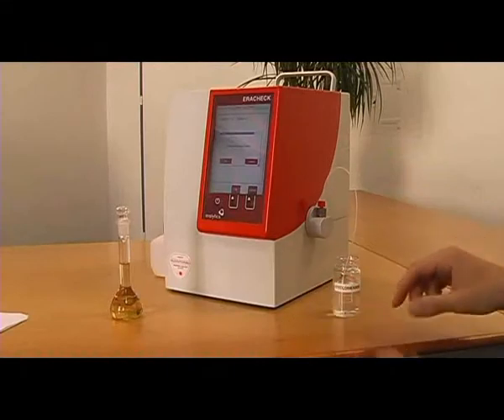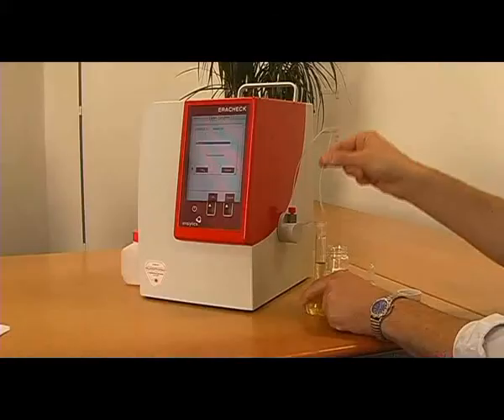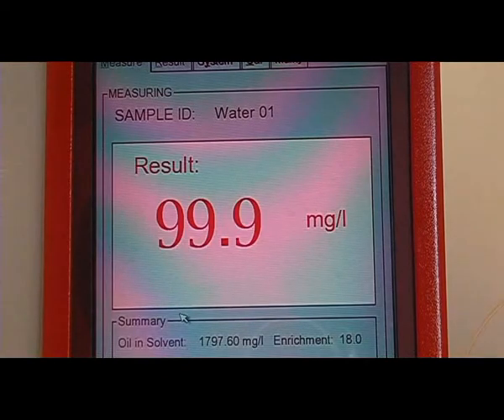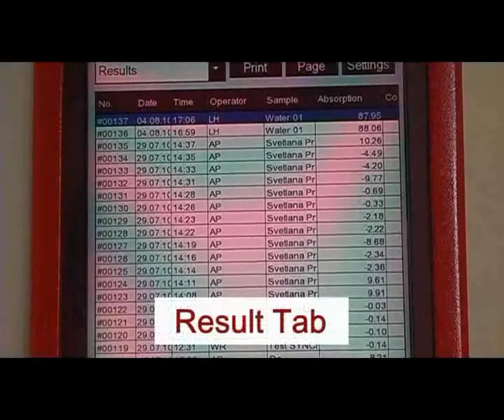At first, insert the sample tubing into pure cyclohexane. Secondly, after being requested, place the sample tubing into the 100 ppm demonstration sample. Each measurement takes one minute. The result is displayed immediately. All results are stored automatically and can be viewed in the result tab.